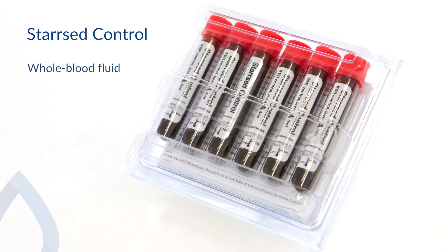Star Z control is a whole blood control fluid manufactured from human red blood cells. Therefore, its sedimentation behaviour closely resembles that of fresh blood.